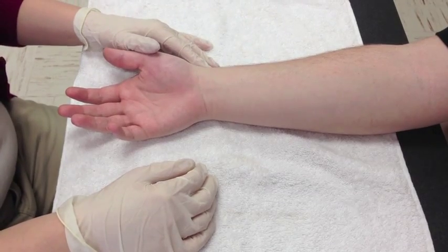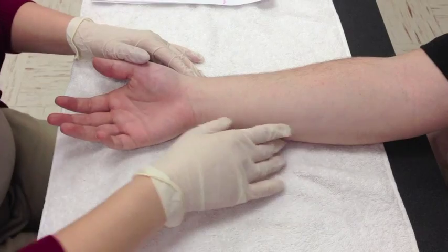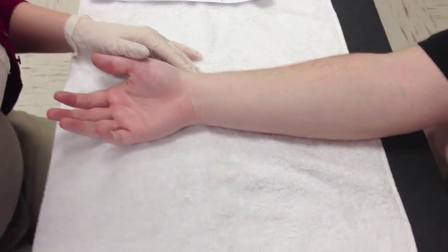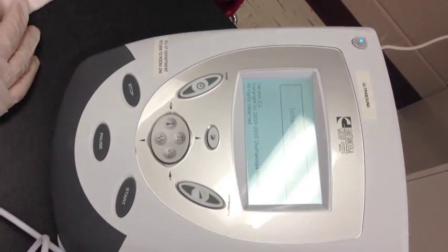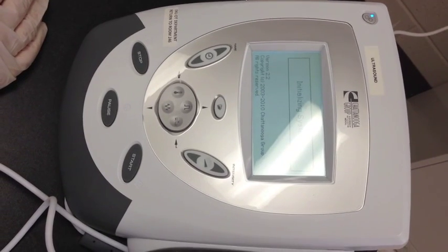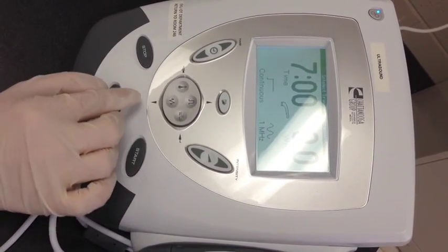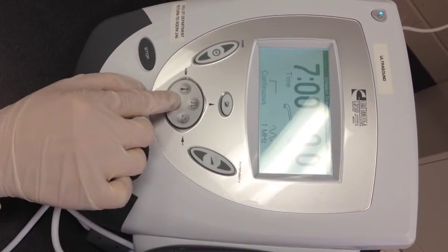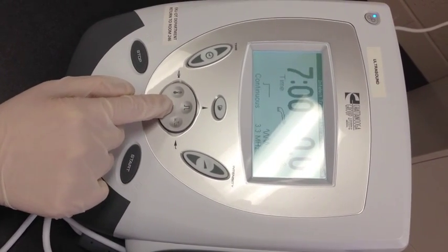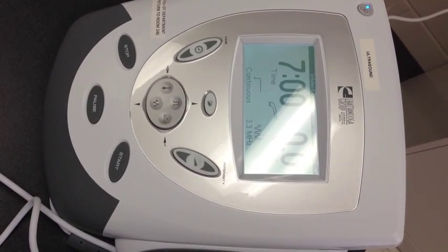The first thing that we want to do is examine the patient's skin. Then you're going to turn the machine on. This is the power button. Then you want to press the frequency button, which is right here. And for this purpose, we're going to press it to 3 megahertz.